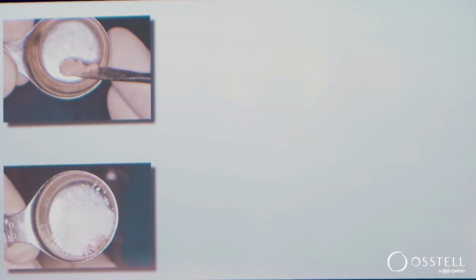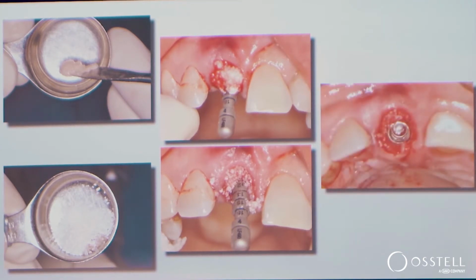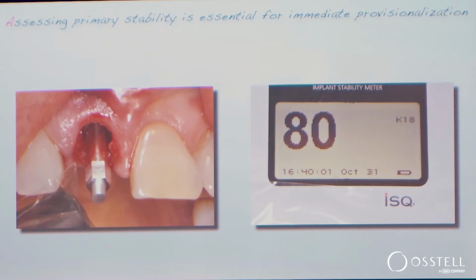That same combination of autogenous bone chips plus demineralized bovine bone, which is slowly resorbing. I like to pack the socket with a guide pin in place in order to make sure we get a good fill, but not over-condense it. Implant is placed to the palatal. And then the key is we need to have good primary stability. Even though there's a lot of facial graft material in contact with this implant, it still has excellent primary stability.